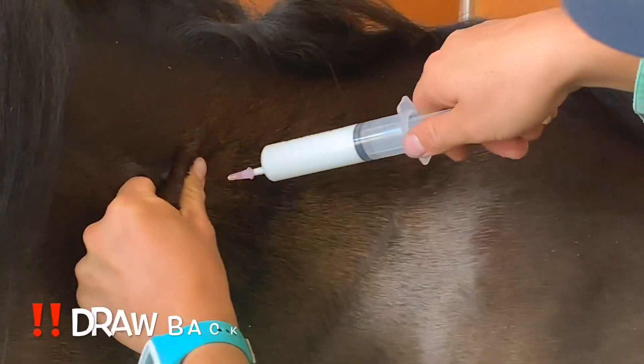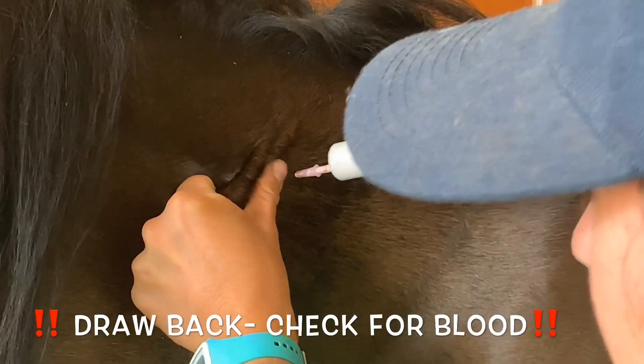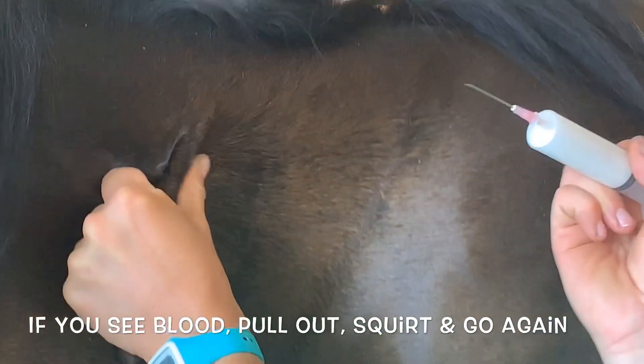Now the really important bit — we're going to draw back. So I pull and we check down here where my thumb is. Is there any blood? Now there is actually a bit of blood. So what we're going to do, we're going to take it out, squirt a little bit away, and we're going to put it in again.